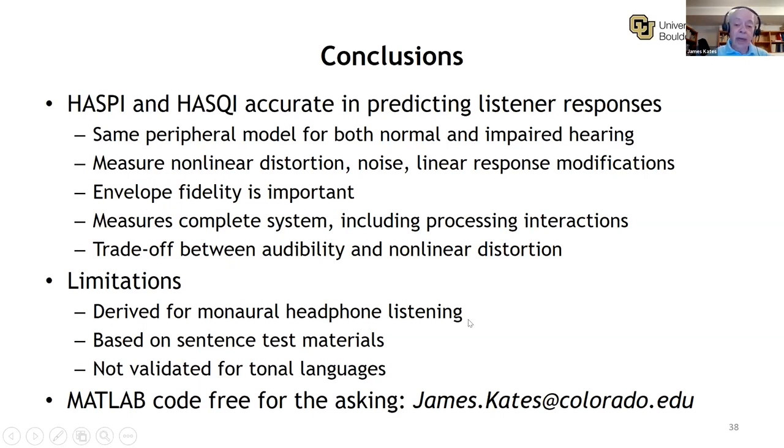Limitations of what we've done in our lab. First of all, we've derived things for monaural headphone listening only. We're now gearing up for a binaural experiment, but we don't have any data yet. We've been using sentence test material. So if you're interested, say, in keywords correct, or phonemes correct, or that kind of analysis, or if you're interested in connected discourse, or paragraph long effect, these models may not give you accurate enough results.